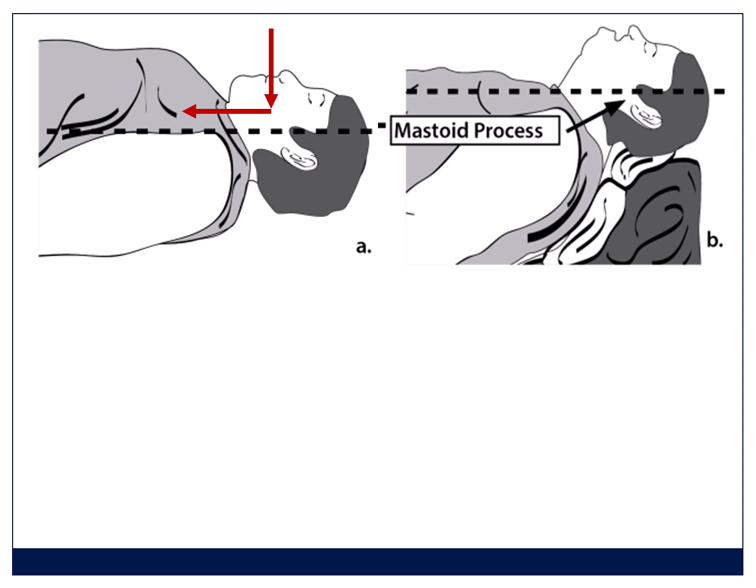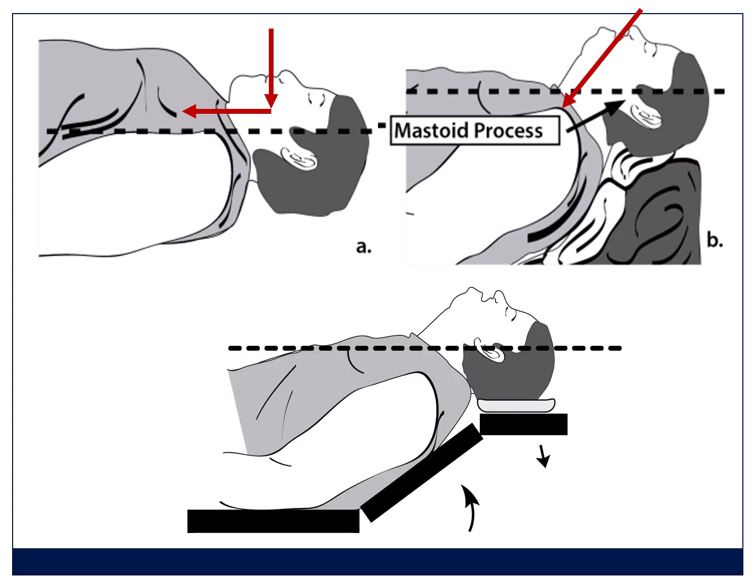If you then get the head above the bed and tilt the head backward in this position, then when you look with the laryngoscope, you're seeing at a better angle. And you can also use this way of getting the head forward. Look at where that mastoid process is. It's come right forward to be in line with the sternum.